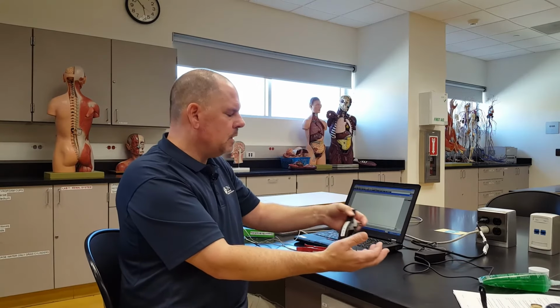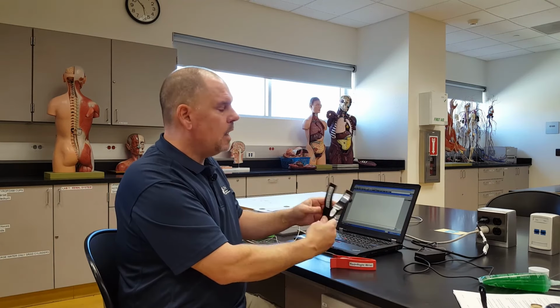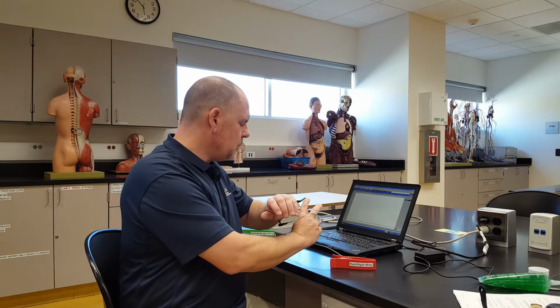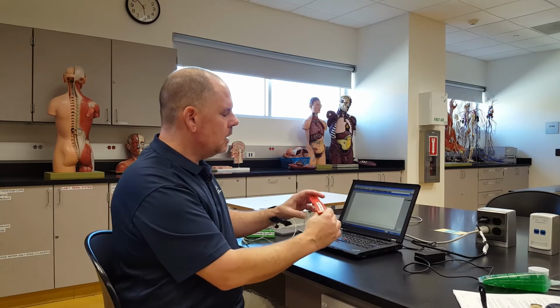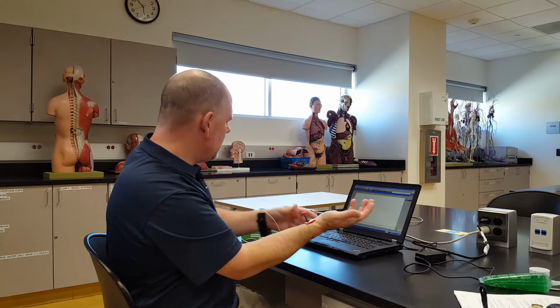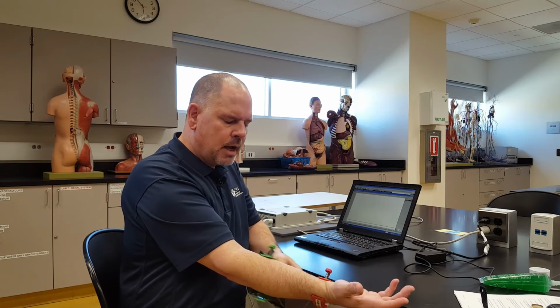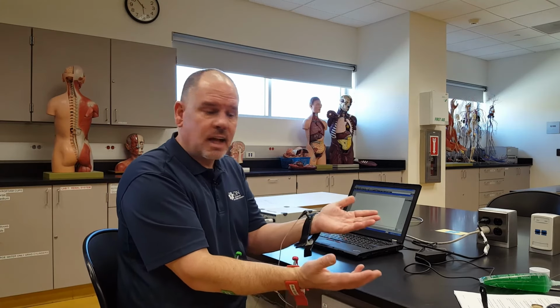Our clothespin leads are labeled. So black goes on the left wrist, see the receiving plate there, a little metal plate. So I put this one on the left wrist. Red goes on the right wrist. Smear some gel around on my plate. And the green is the ground, which typically goes on the ankle or up higher on the forearm of my patient, in this case myself.